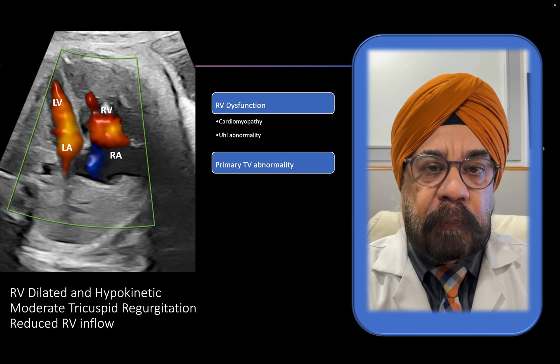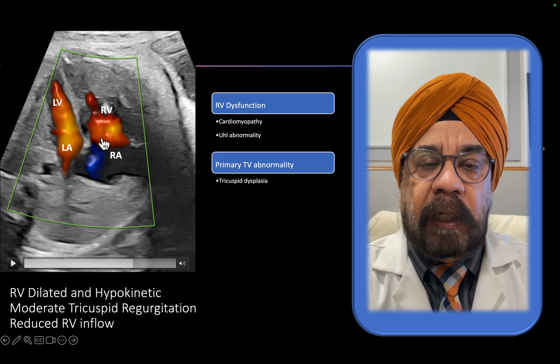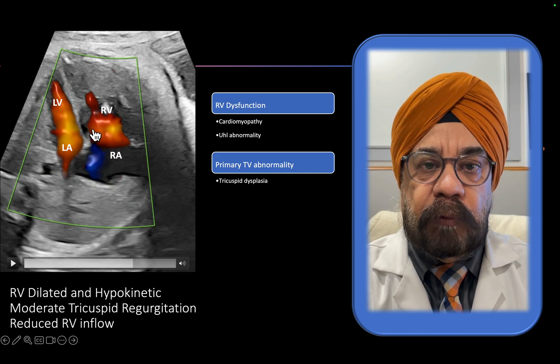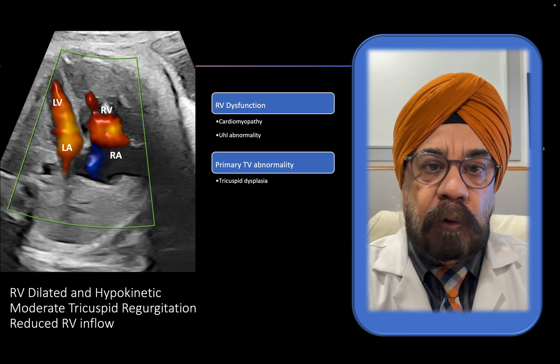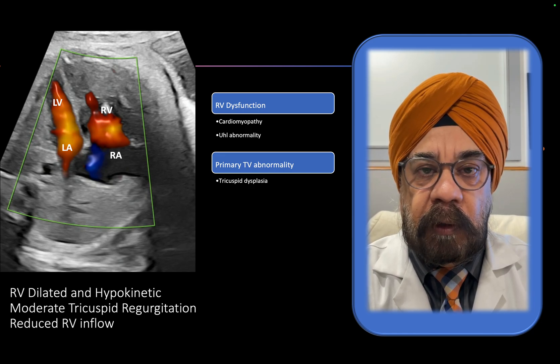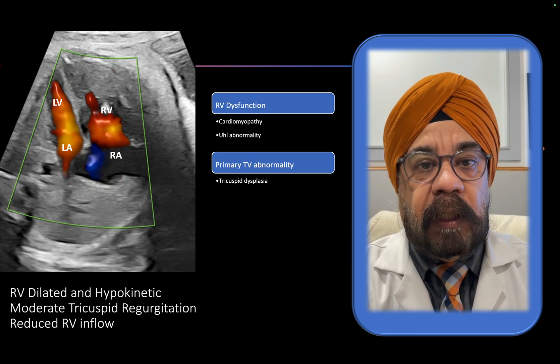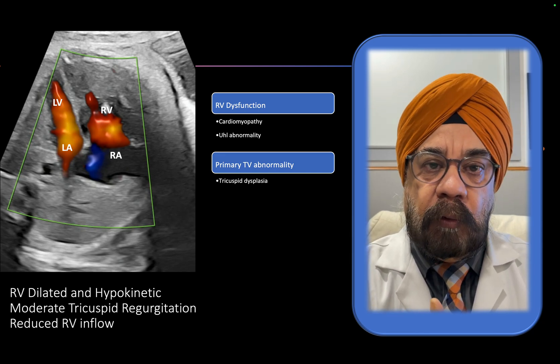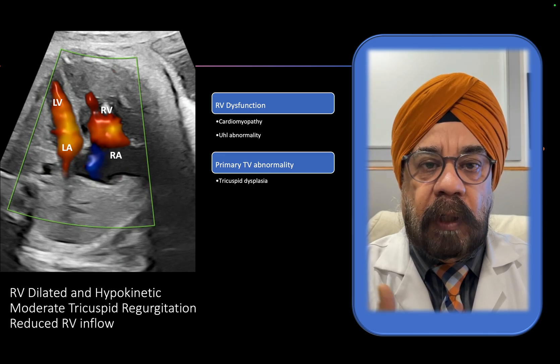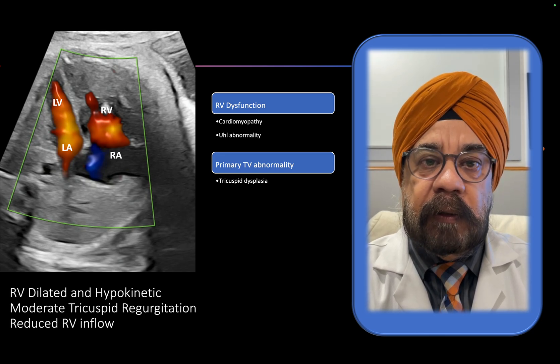The second possibility is a primary tricuspid valve abnormality such as tricuspid valve dysplasia. Ebstein's anomaly doesn't fit because there was no apical displacement of the septal leaflet of the tricuspid valve. Also, in a primary tricuspid valve abnormality you would expect increased RV inflow — because TR causes backflow and the blood returns to the RV — so RV inflow should be greater than usual. Here the RV inflow signals are reduced, which argues against this.